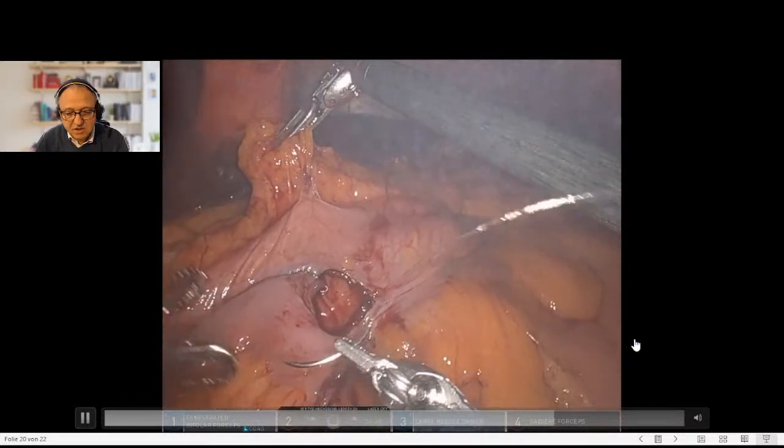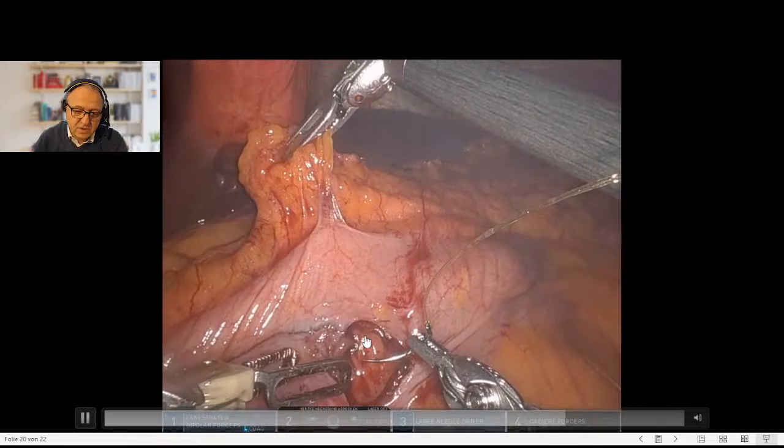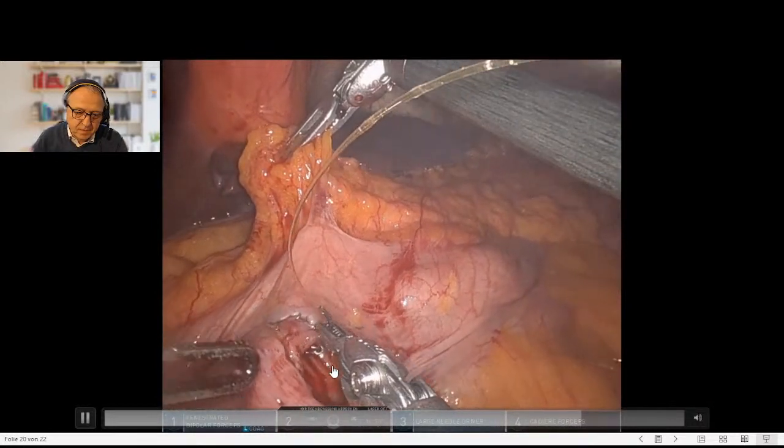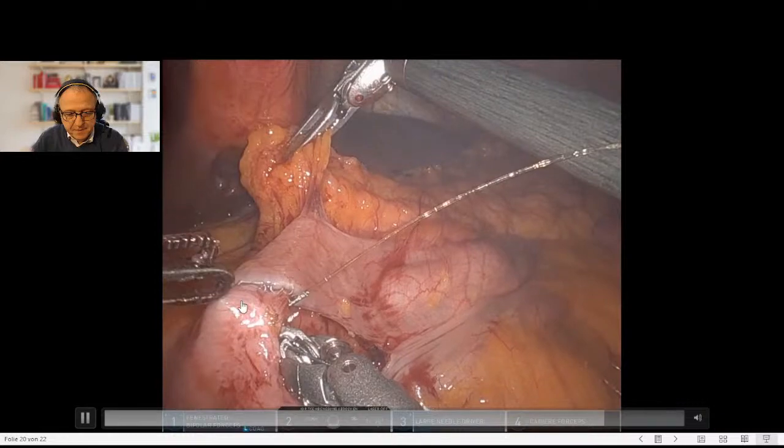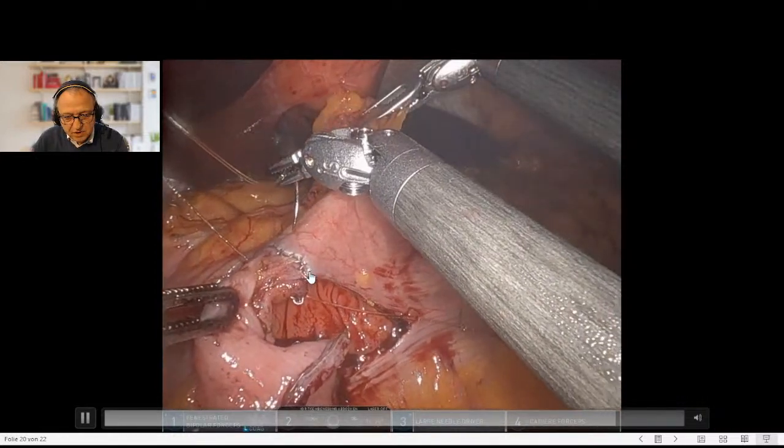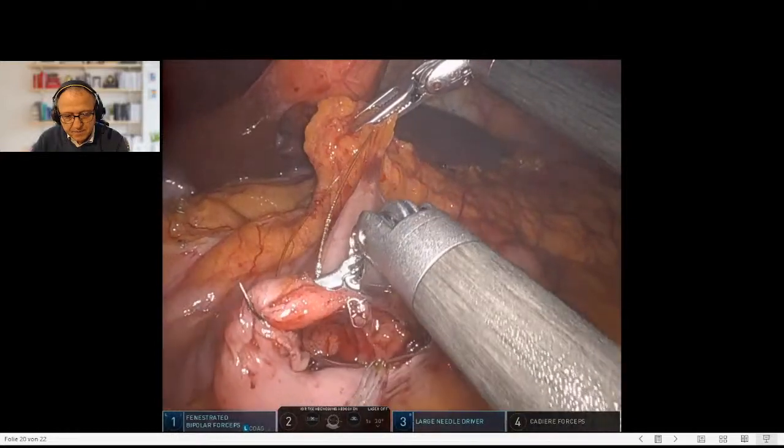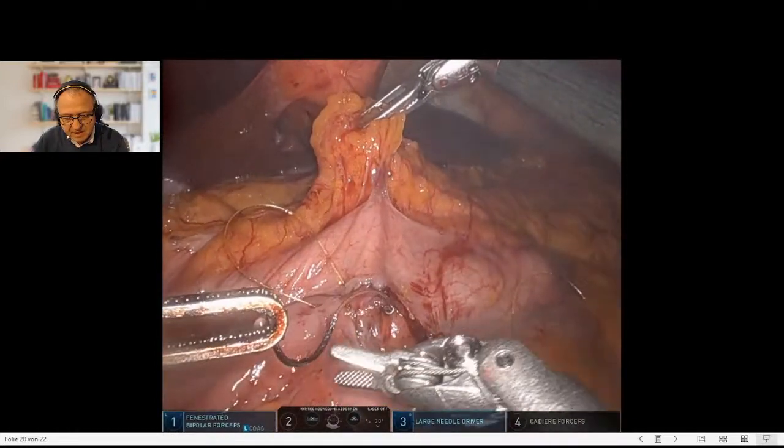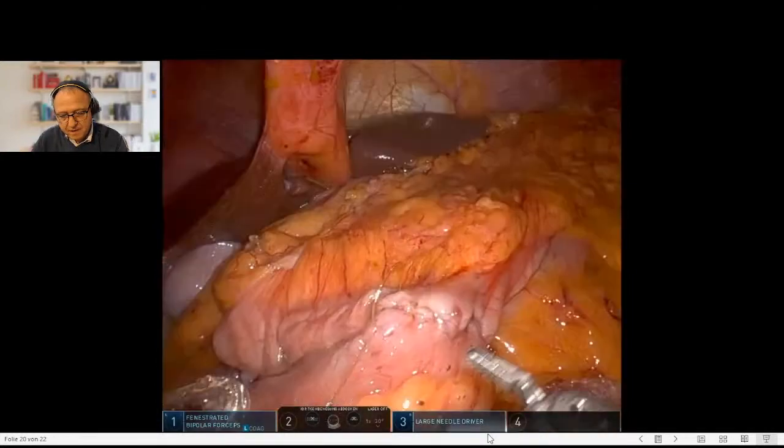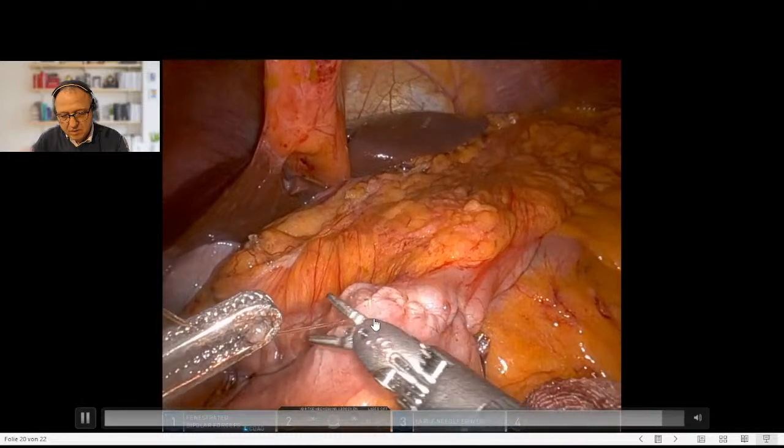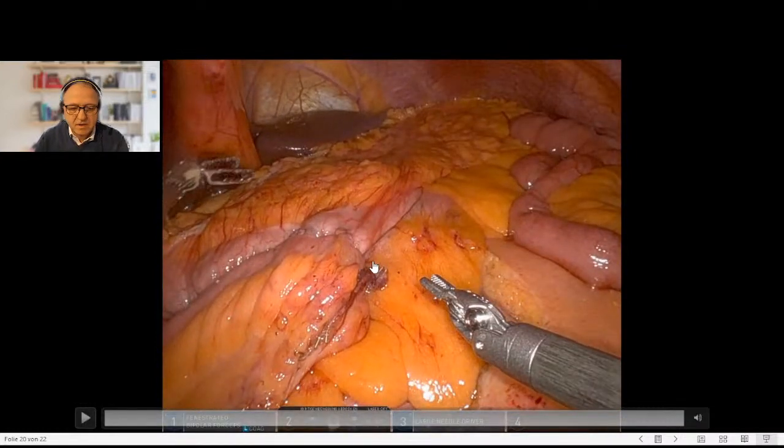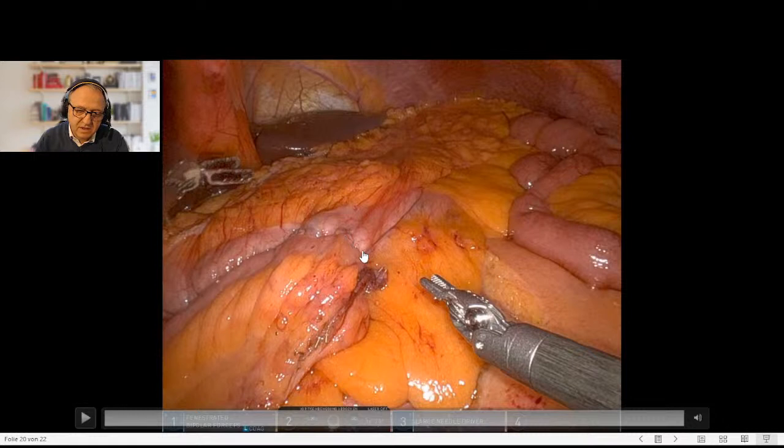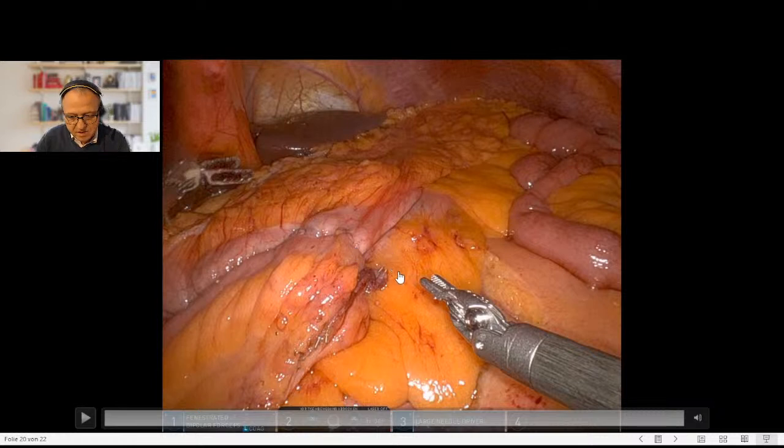That's the intracorporeal anastomosis. We start from each corner. I put the first stitch from inside, then use this suture for retraction. The second suture is placed at the other corner. Then we suture in both directions. The sutures cross in the middle and so a double layer suture of the anastomosis results.